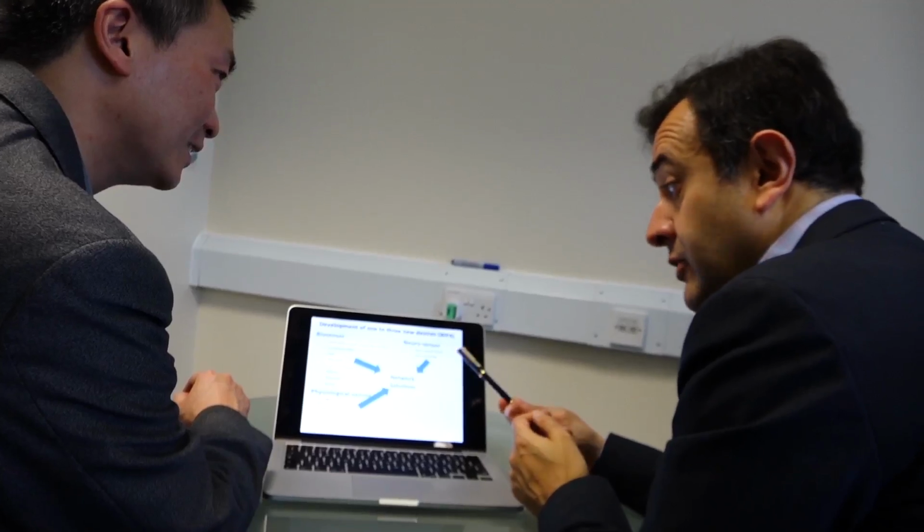The subtle color change of the skin is caused by the arterial pulsation. So if we know that a certain part of the skin has lower pulsatility, we know that the perfusion is lower in that part. So by using these two features, we hope that we can monitor a liver patient at home and then provide early diagnosis.